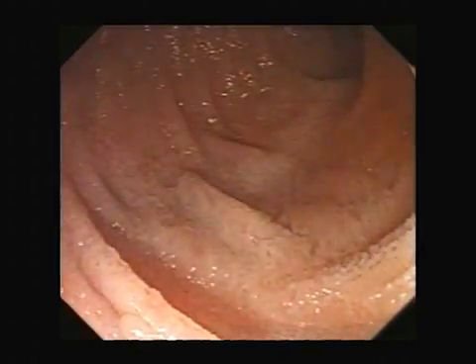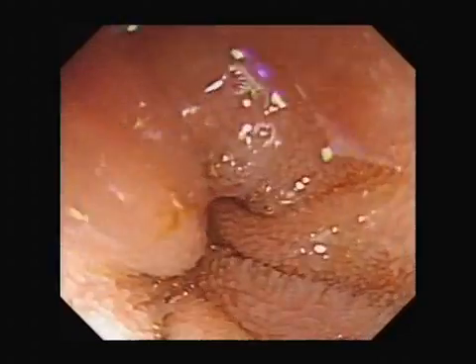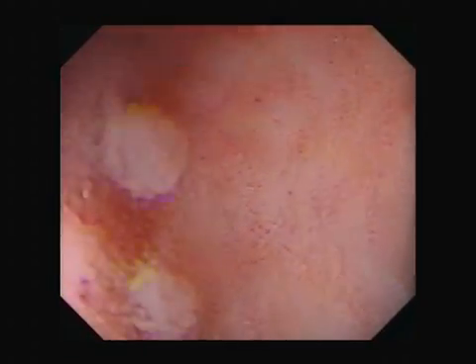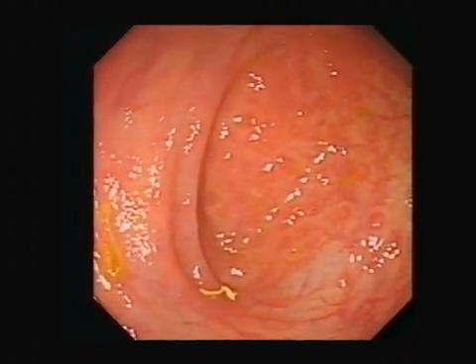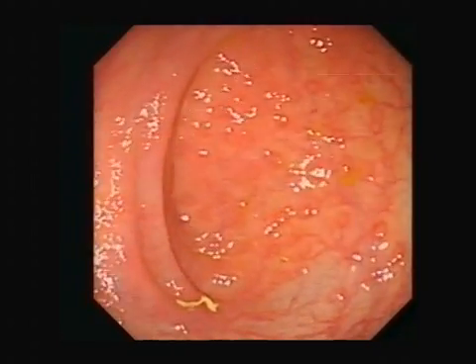Ileal villi can be relatively short, even when seen underwater. Or the villi can be longer. And there may be lymphoid nodules in younger patients. The appendix region, too, often has prominent lymphoid follicles.